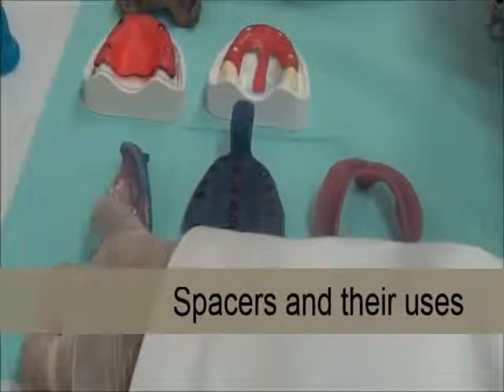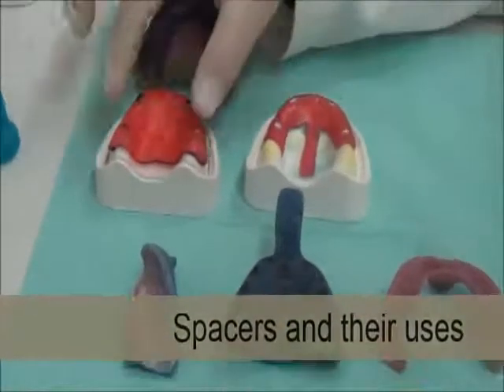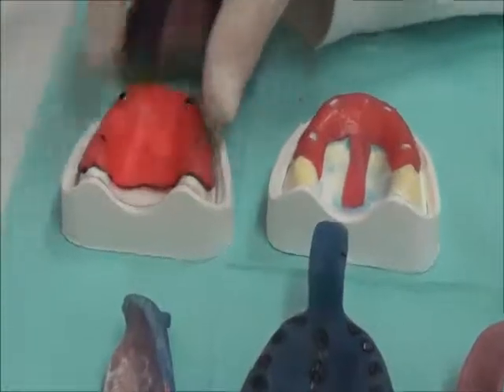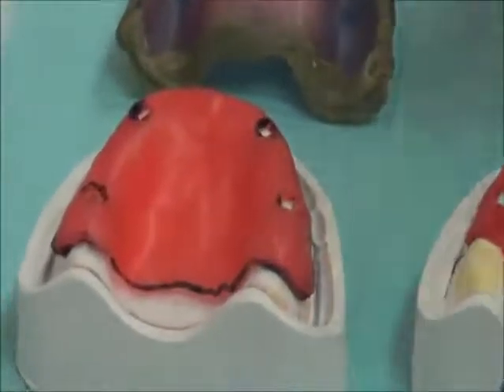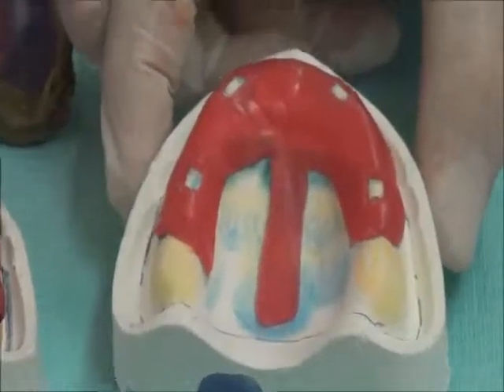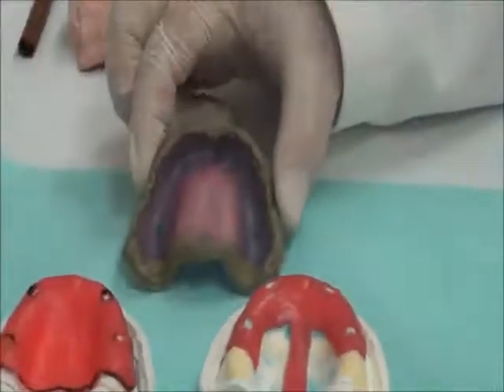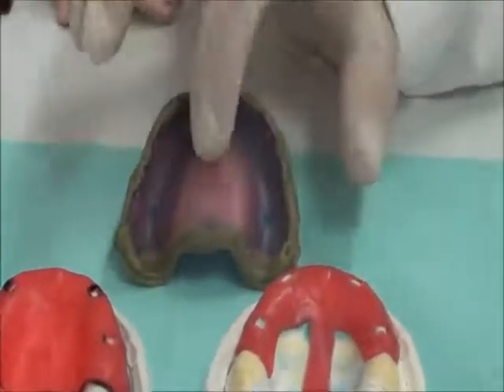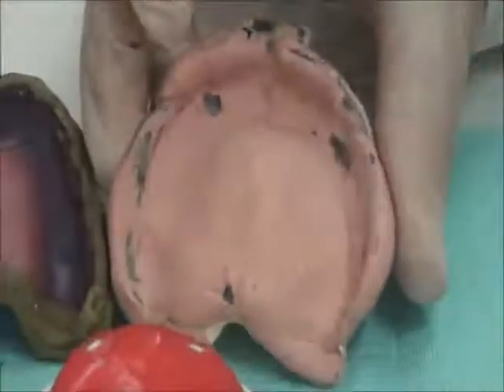The trays that have a spacer, some of them have complete spacer following all of the tray outline from the inside, or partial spacer. Remember that at the clinical step, we're going to remove the spacer once we take the impression. So the impression is not taken with the wax inside.